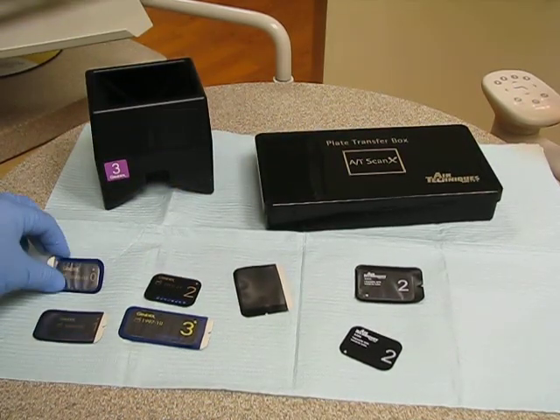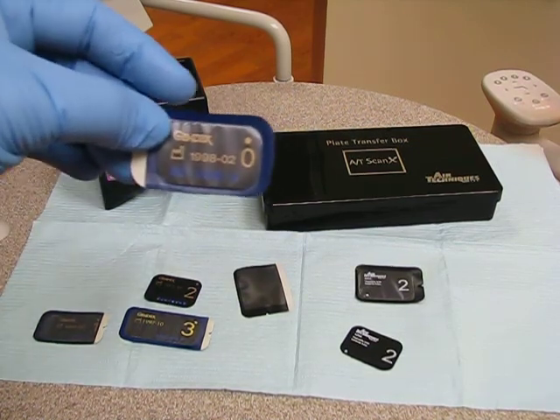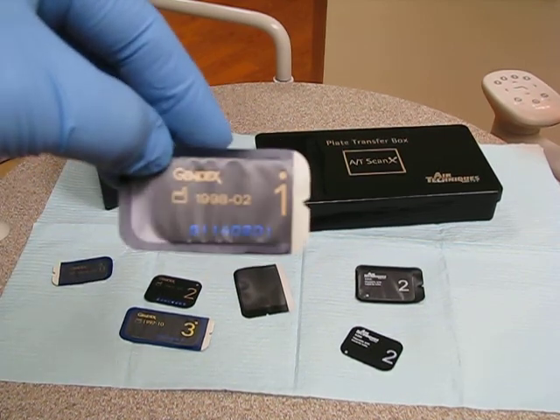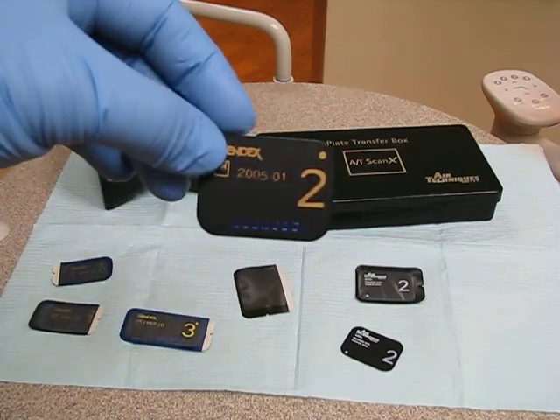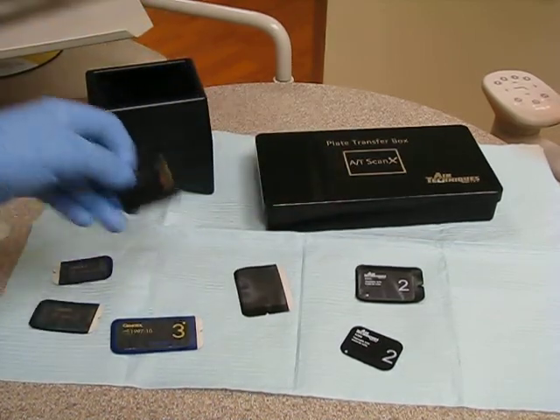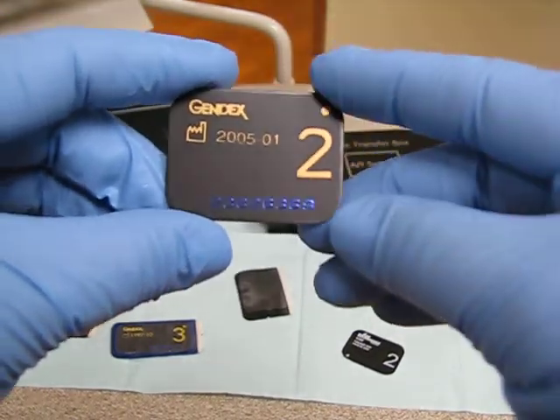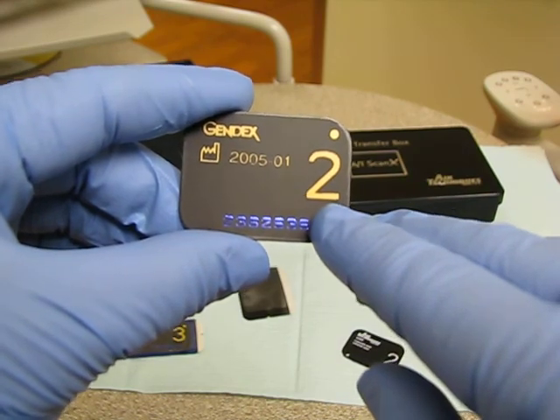There are different sizes. There's size zero by Gendex, size one, size two which we're familiar with, and size three. This is a Gendex product sensor. Notice that it has a big '2' on it — that indicates the size of the sensor.